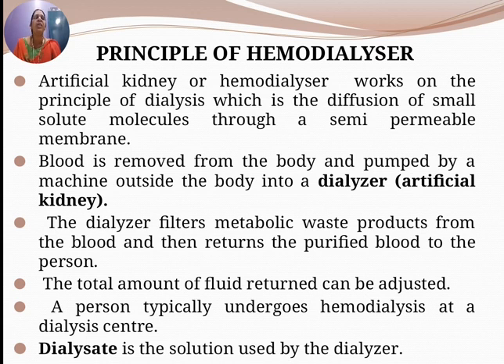This dialyzer replaces the working of the kidney. So the dialyzer, what does it do? It filters metabolic waste products from the blood and returns the purified blood to the person. The amount of fluid returned can be adjusted.